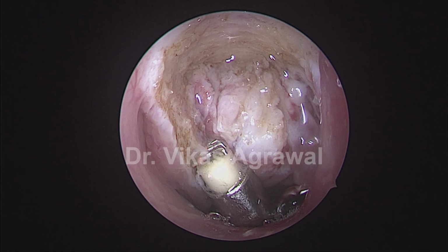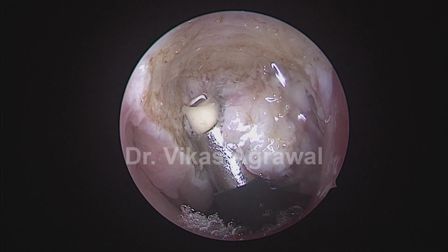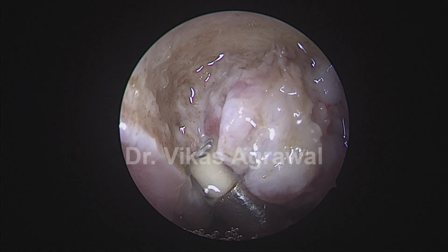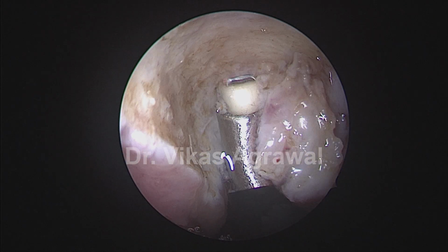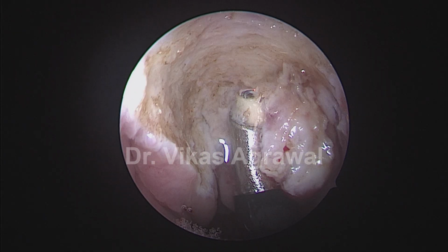And now the lateral boundary posteriorly is the fossa of Rosenmuller. So that's the fossa of Rosenmuller. From here, we go into the fossa of Rosenmuller and completely eliminate the tissues from the fossa of Rosenmuller.